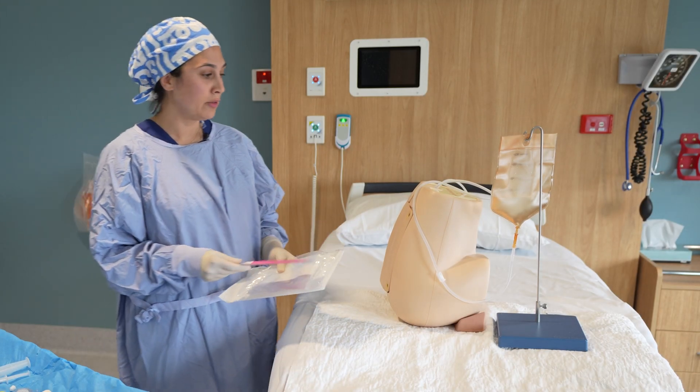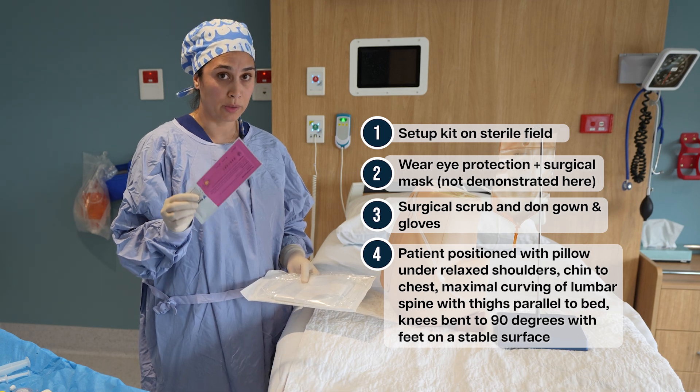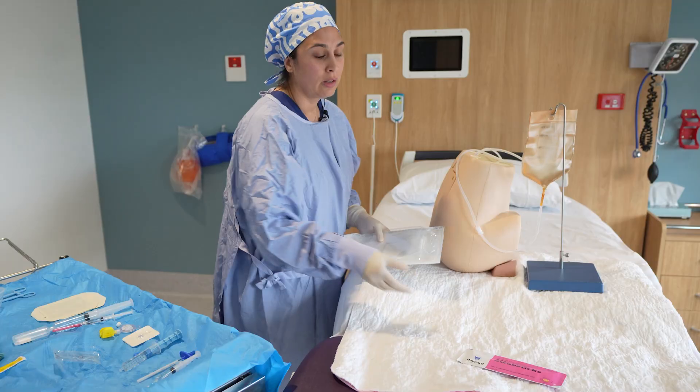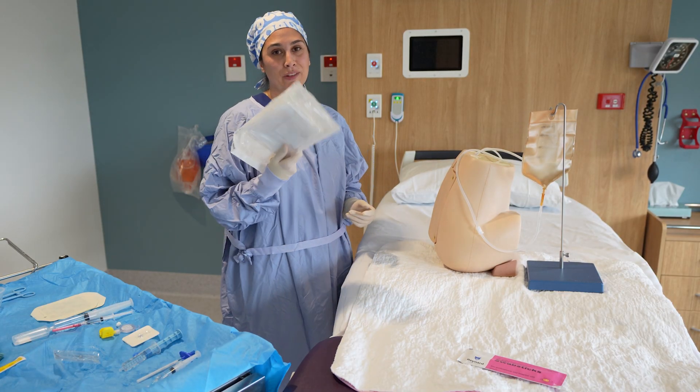Once you're ready to go, your assistant would have prepped the back with the 0.5% chlorhexidine lollipop. Make sure it's not the 2% chlorhexidine lollipop — those also exist. After setting up your trolley nicely, the first step is to put the drape on.